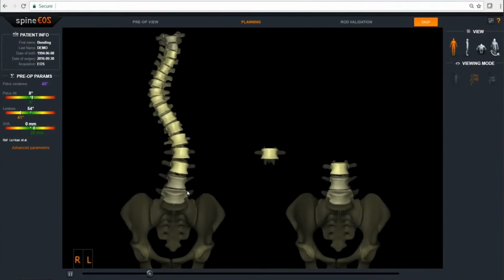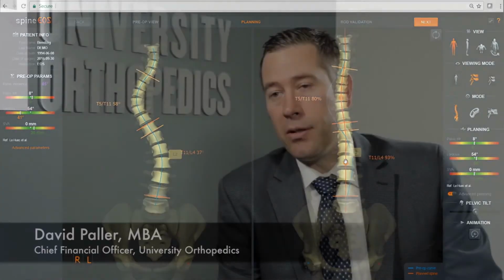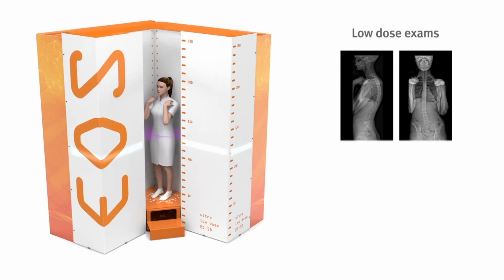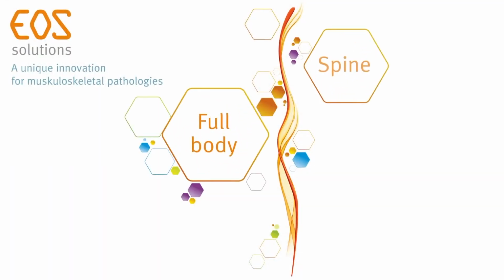What was important to us was to understand from the clinicians what else you could do, really why it was better. We understand that it's lower radiation, and so that's advantageous to the patient. But are there other advantages too? And so what we found was it's faster. So I think it's more efficient. We could do more scans. Patients are happier. You could do a full scan in 3 minutes that might take you 12 minutes with a traditional X-ray machine. And so from a reimbursement standpoint, you could do more codes in less time.